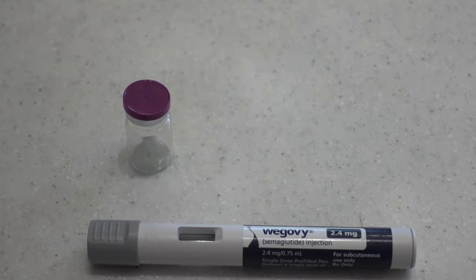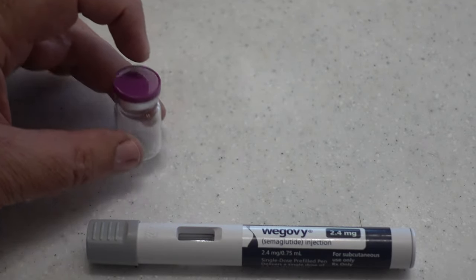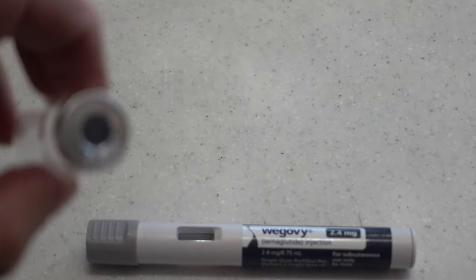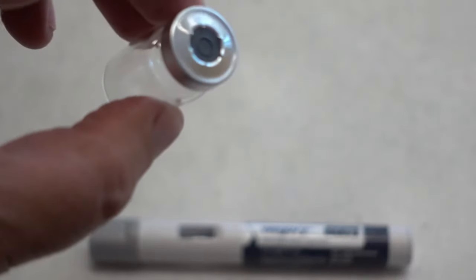To begin, first we will need to remove the plastic cap from the 5 milliliter vial, and that will reveal the self-healing injection port.